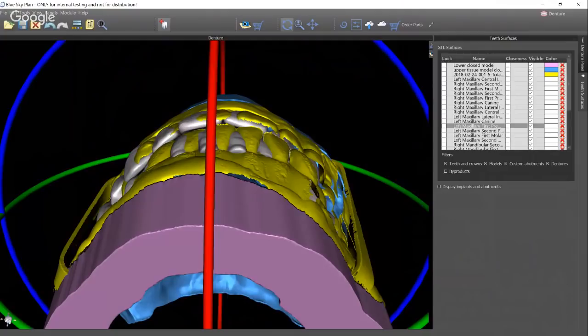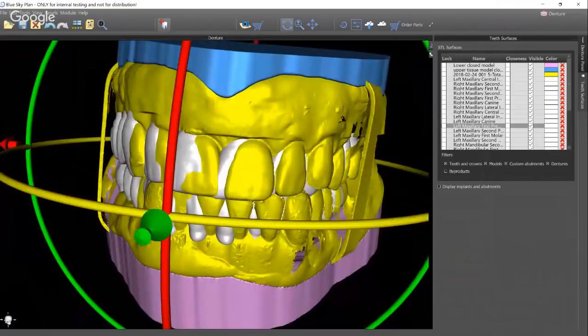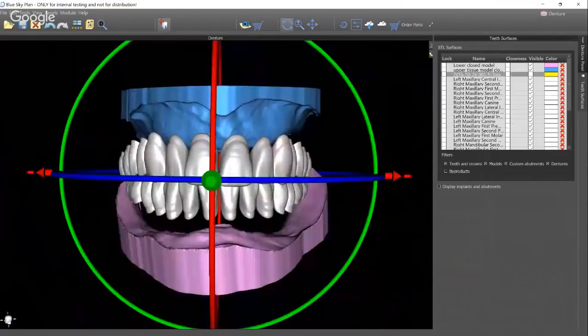And here I'm looking, if you remember back, there was a bit of a discrepancy on the midline, and so I'm scooting the midline over a little bit compared to where the existing dentures were. And once again, showing that. And so the teeth now are in the final position of where I want them.